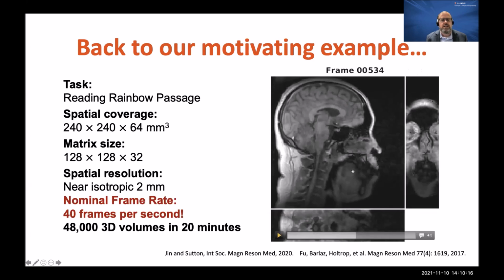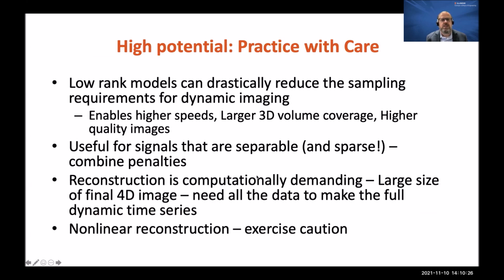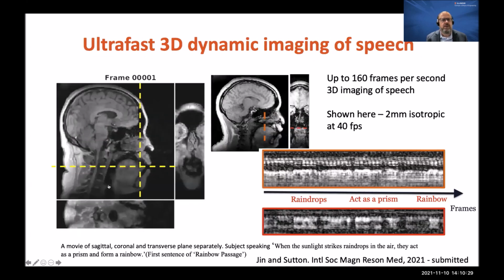Okay, and we're interested in things like tongue movement and velar movement here. But when I'm playing this, we're all looking at the center slice here. It turns out there's significant information in the other directions too. So let me just show you that first.